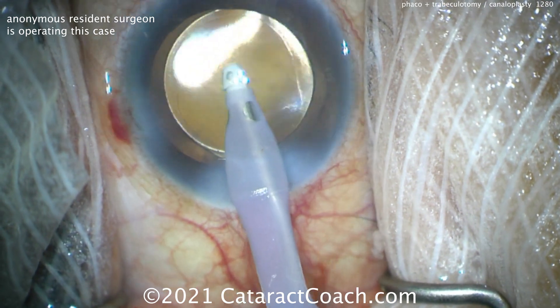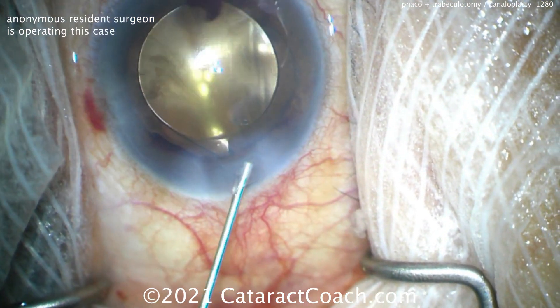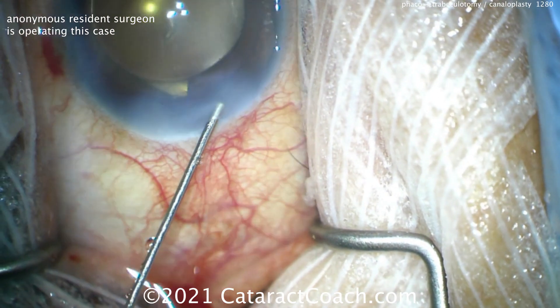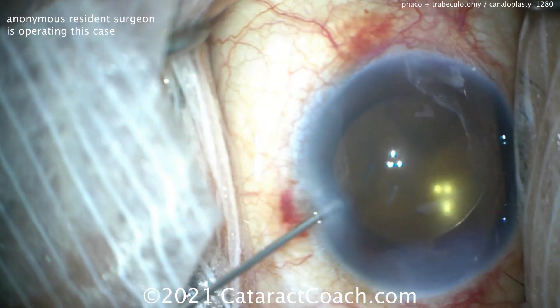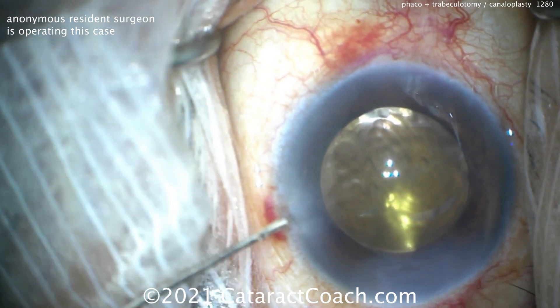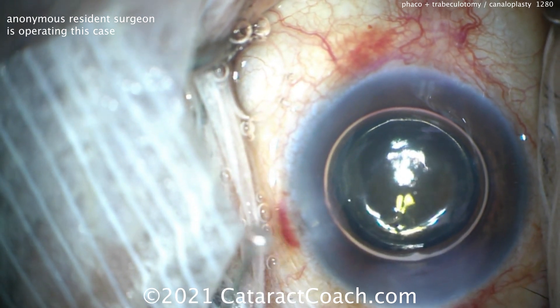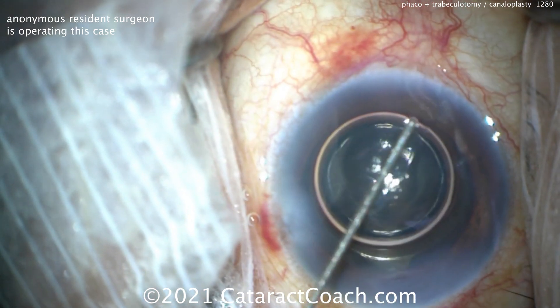And we all learned from him. But certainly if you're a cataract surgeon, you need to know how to do MIGS devices — they're very easy to do. So now let's seal up the incision — get that nicely sealed up. Good incision by the way. If you need to, put a suture in; I think this one will be fine without a suture because it's good architecture. Then wash out some more of that heme. Temporarily we'll get the IOP very high just to help stop some of the heme — maybe 30 to 40 millimeters of mercury temporarily. Then at the end, a little bit of viscoelastic, the IOP is now more normal, and a little bit of an air bubble — just that much. And that's going to help prevent more bleeding in the post-op period. Seal up the incision, get the pressure where you want it — I'd leave the pressure maybe in the 20s; I wouldn't leave it too high.